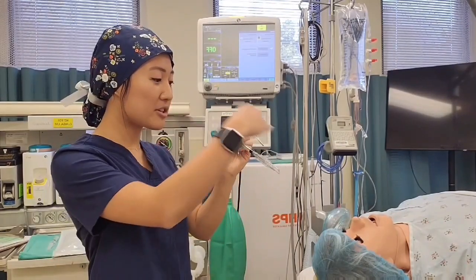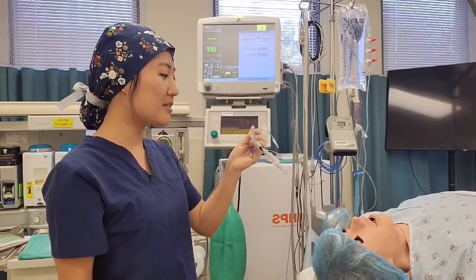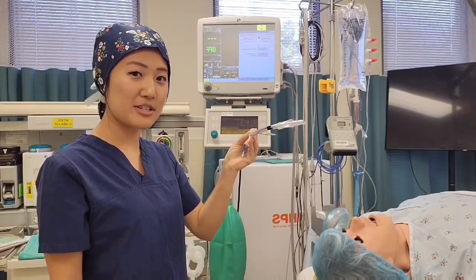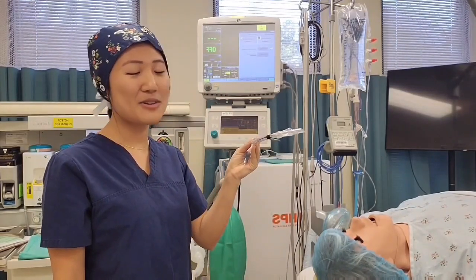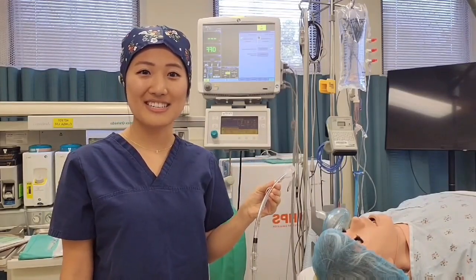That way you get a much clearer view of the airways and you can simply roll the tube in between your fingertips to change the angle with much ease. Let me show you a demonstration on the video laryngoscope.